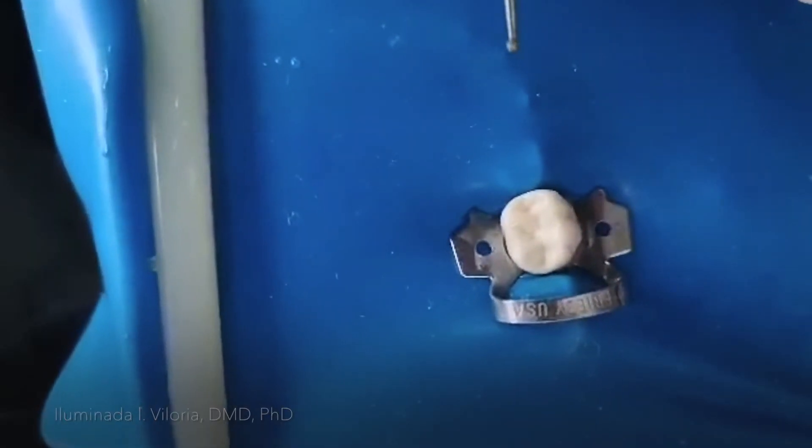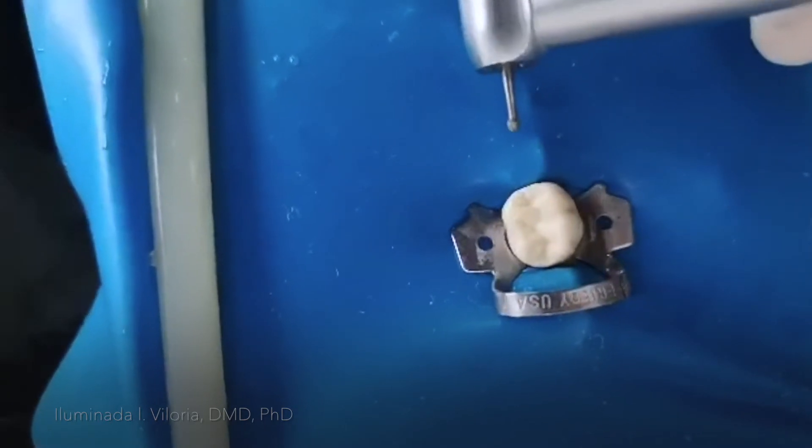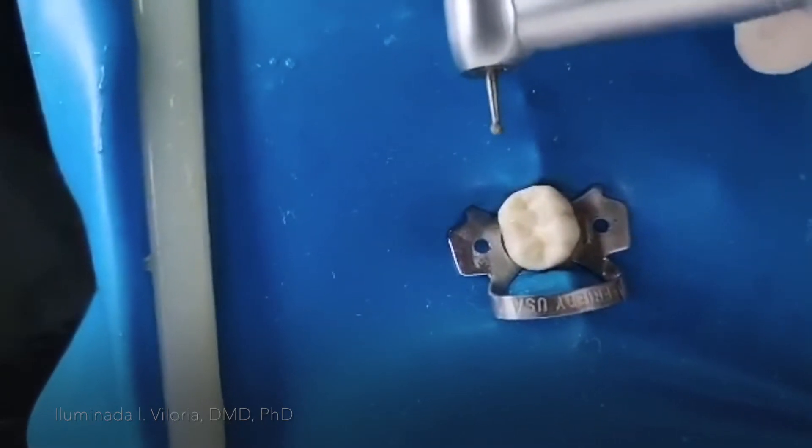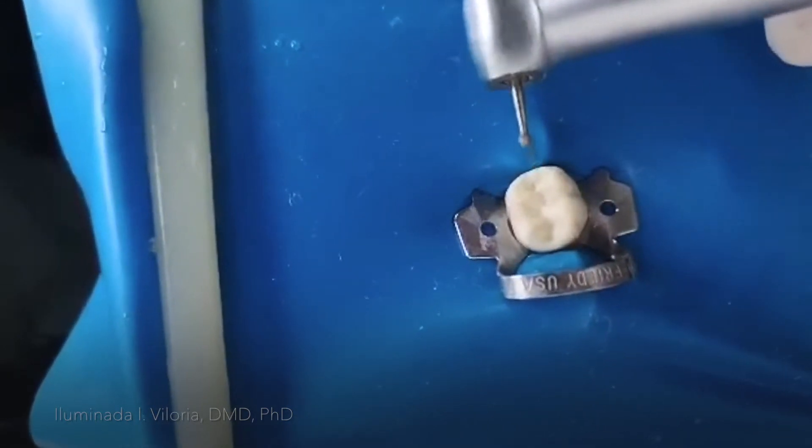I'm going to do access cavity preparation of the mandibular first molar. After studying the preoperative radiograph and analyzing the pulp chamber, I'm now ready to drill.